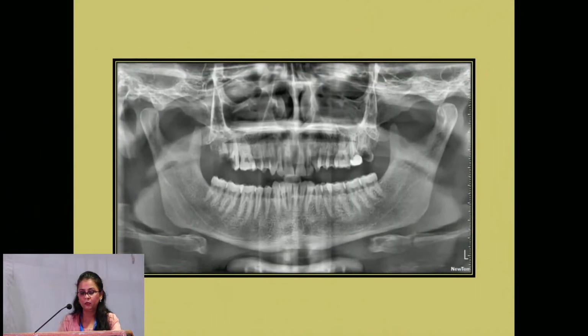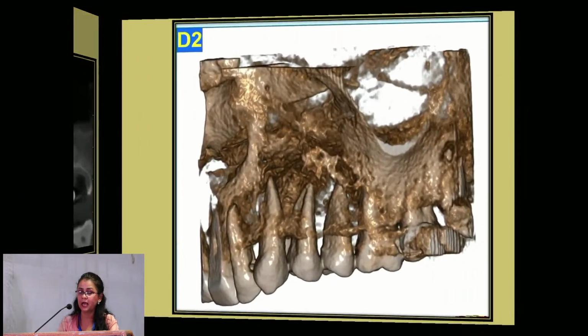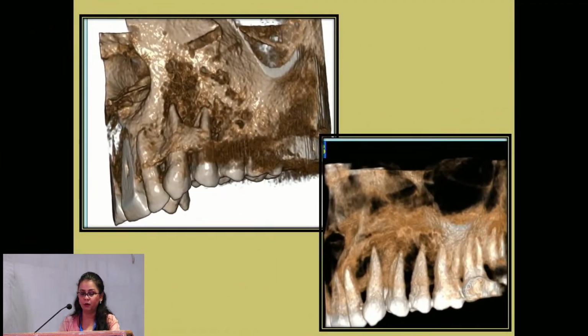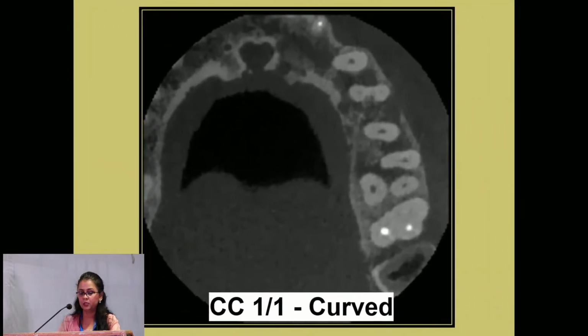A little bit about the cases during my COVID-19 period. I can see a 2D image, then I see a destruction of the maxilla. See the osteomyelitis type of destruction that I would see in cases of COVID-19. So the involvement of the maxilla, whether the involvement of the sinus, of the ethmoidal bone, or it's a mild form of destruction. So the whole bone was showing an osteoporotic type of appearance. See the radiolucency at all the levels I have seen in the axial section.